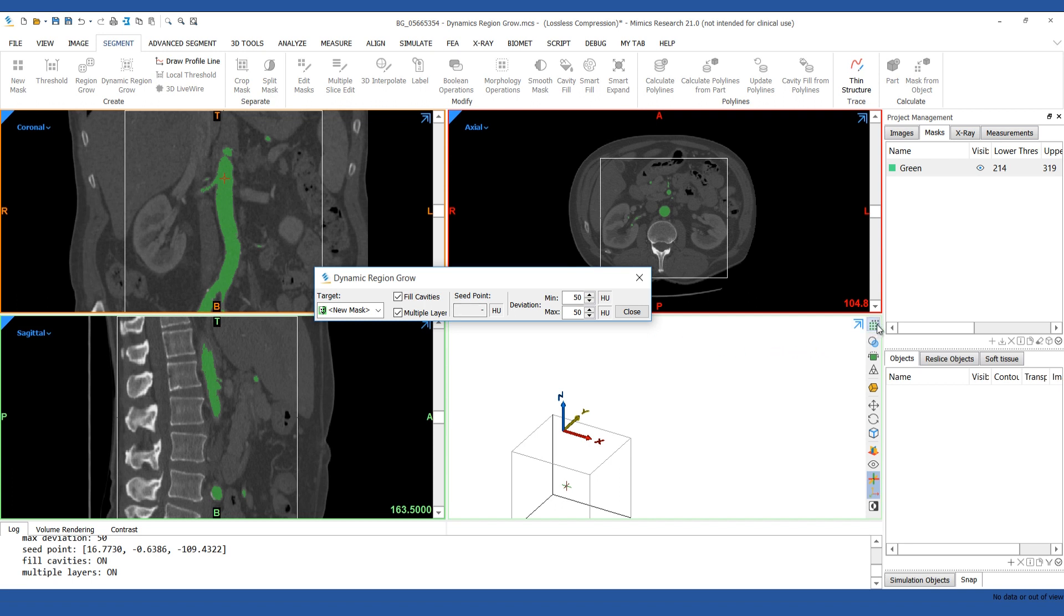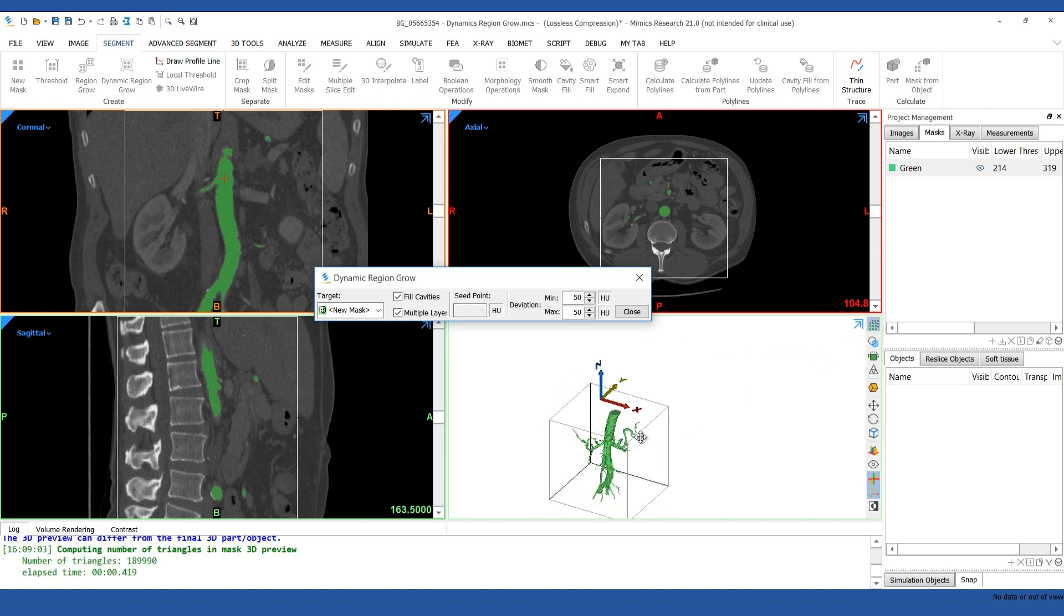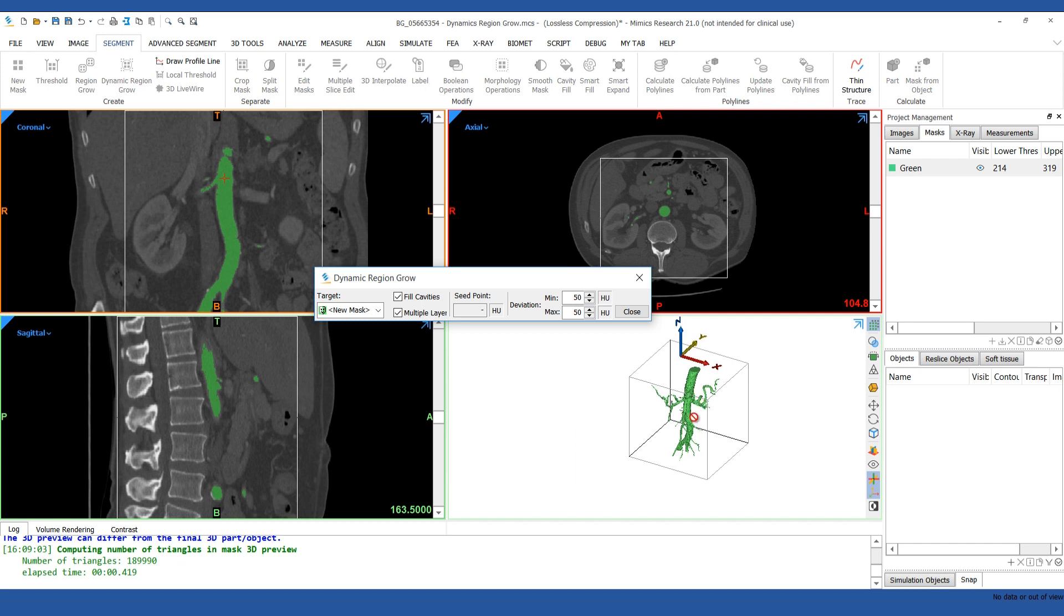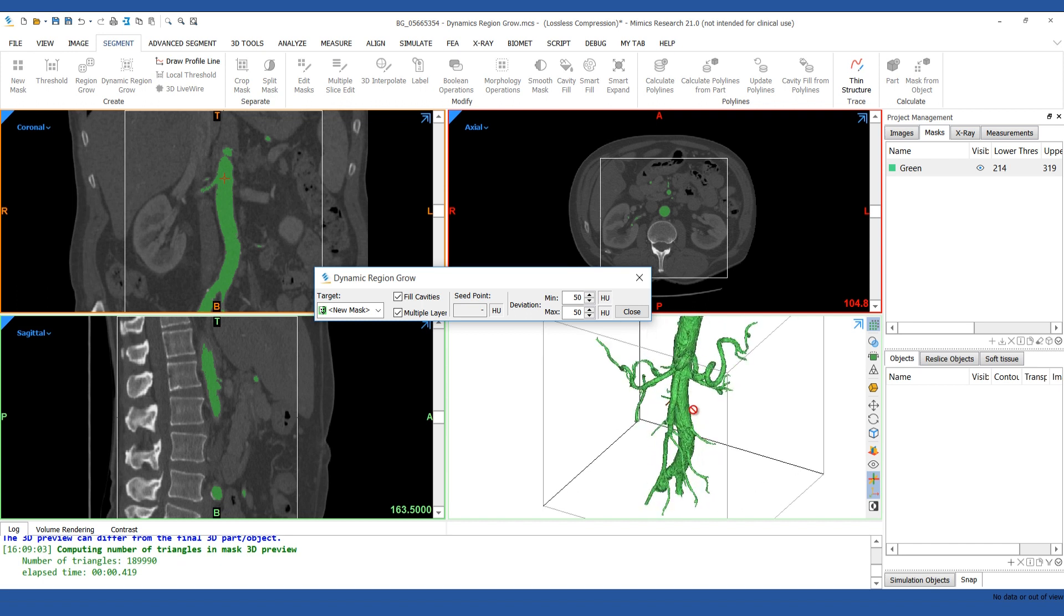We'll turn on the 3D preview and you can see that with this simple process, you get segmentation of the blood vessels.